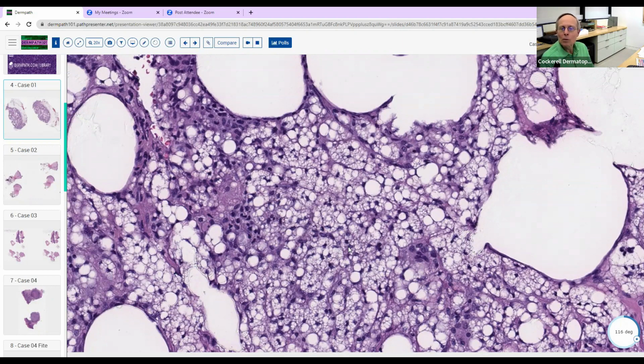But just think in terms of the biochemistry, if you will, of things that give you clear cells. So one would be lipid or fat. What's another thing that looks white under the microscope that's not fat? I'm trying to think. I'm having a hard time coming up with stuff.